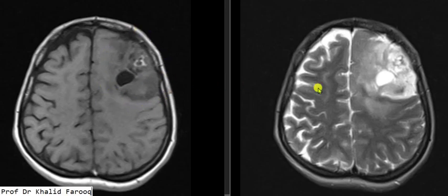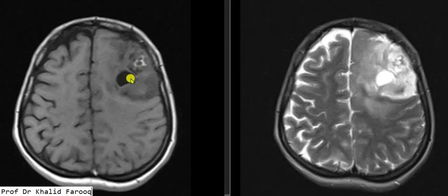Both on T1 and T2 weighted sequences, we have an irregular high signal intensity area on T1 weighted image suggesting a hemorrhagic component. We can also see low signal intensity areas favoring necrotic foci. This is basically a mass lesion.